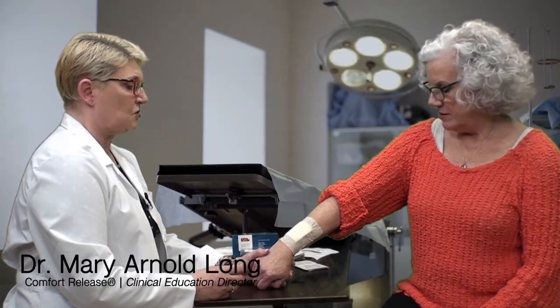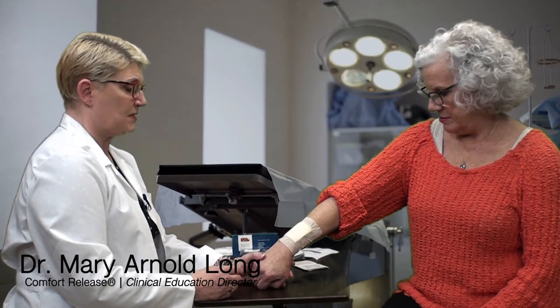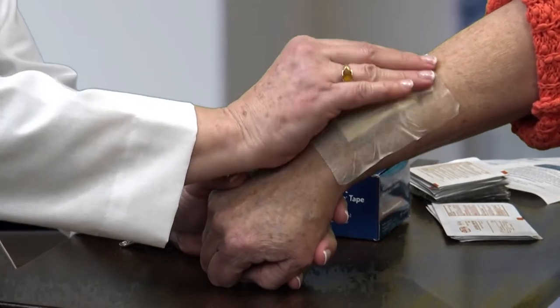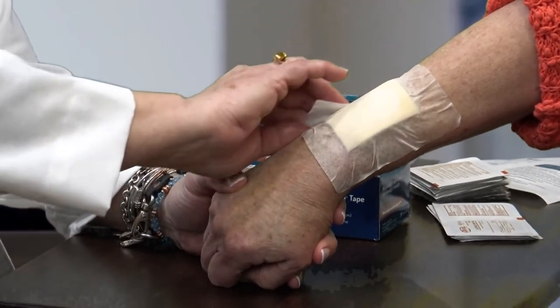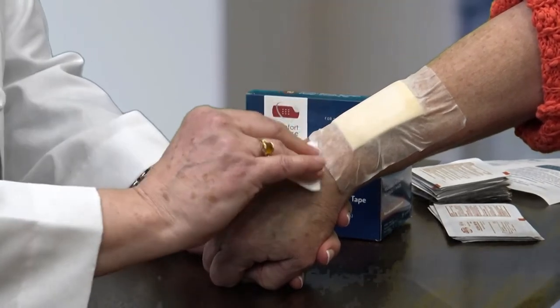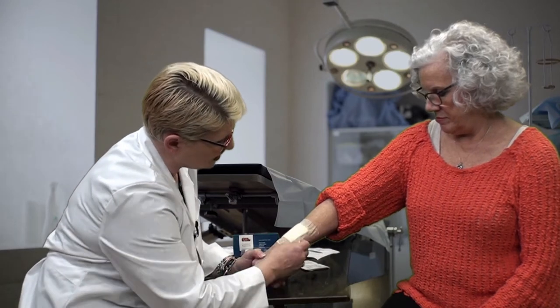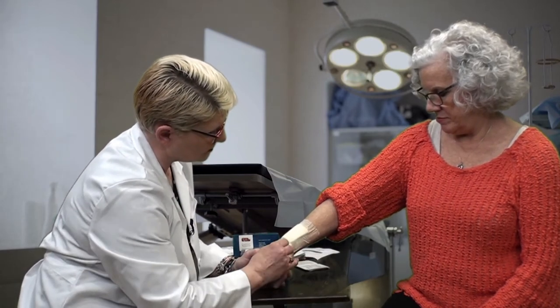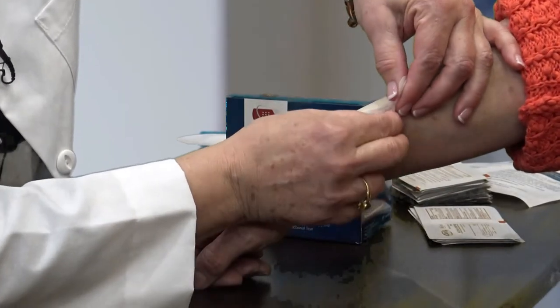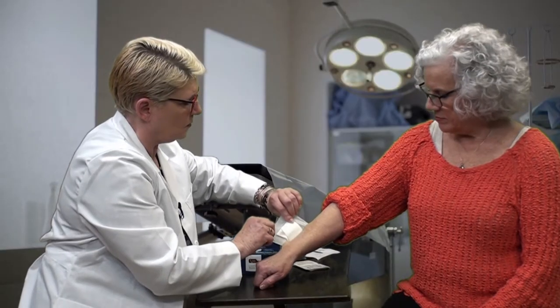I'm now going to demonstrate the removal of the Comfort Release bordered foam dressing. I'm going to take my alcohol wipe and wipe the entire border of the dressing until it turns from white to translucent, and then gently lift and peel the dressing away.